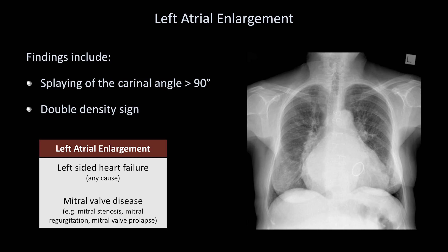For this particular x-ray, there is a clue as to why this patient has a large left atrium. While the overall size of the heart is enlarged, suggesting heart failure, assuming this is a PA film, there is another important finding: a round structure here, which is the ring of a mitral valve replacement. So this patient has had some form of mitral valve disease that at least contributed to the enlarged left atrium.